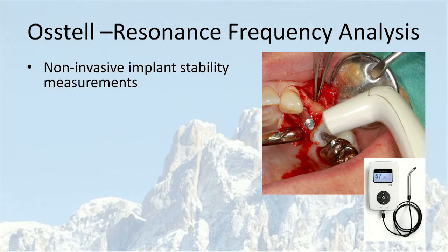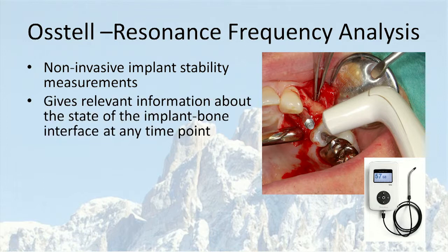And I would like to make some statements before we start. This is a non-invasive implant technique for implant stability measurements. And we know now from 20 years of use and research that it gives relevant information about the state of the implant bone interface at any time point during the treatment and follow-up of the patients.